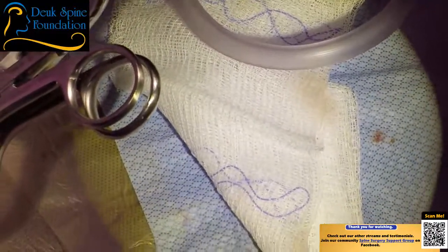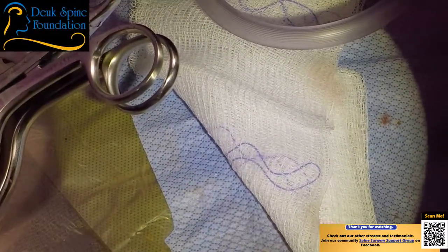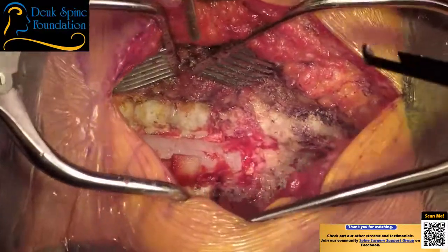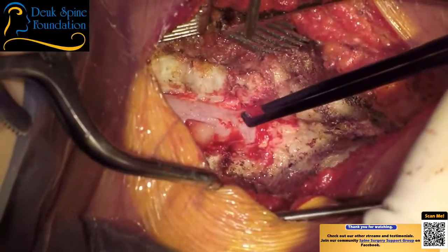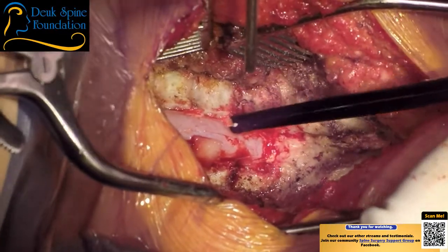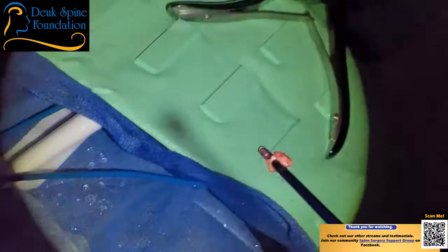Is this a three? That's a three? That's a two right now. I need a three, please. I'm going to try a three. See if we can get it in there. I may need a two. Yes, you really can't push on the spinal cord. It's illegal. It's a 5-yard penalty.